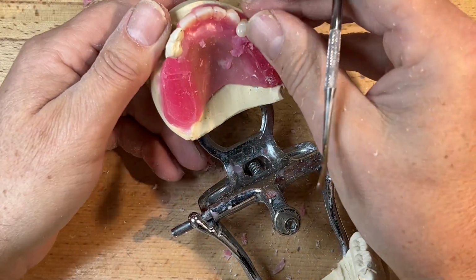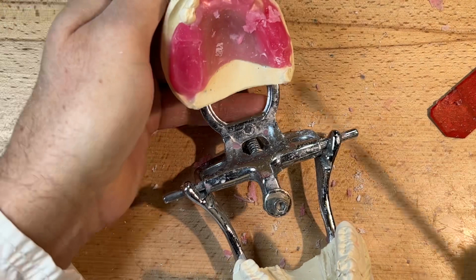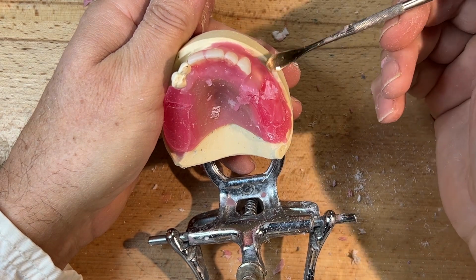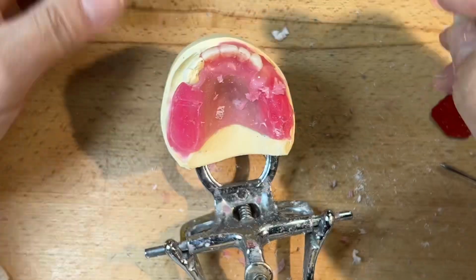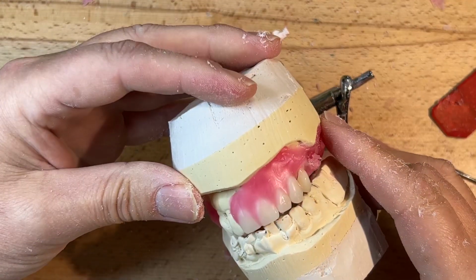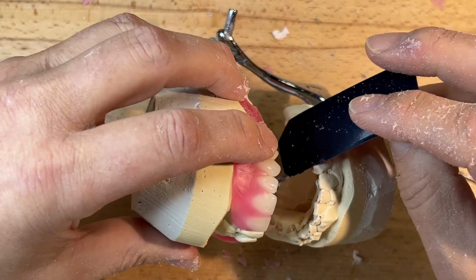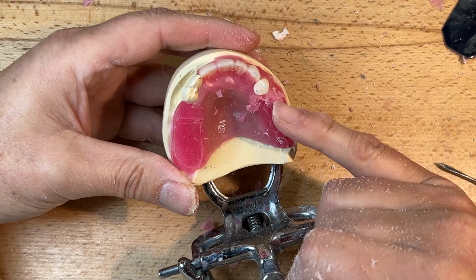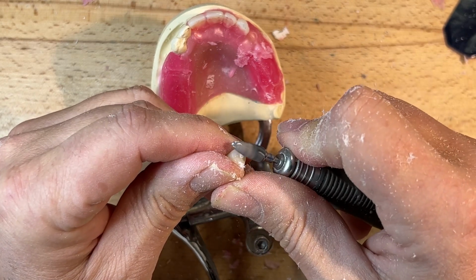Now, the anatomy of this denture tooth is contrived. I'm going to customize it to maximize interocclusal contact in centric relation in this vertical position. I'm going to leave it slightly high, just slightly high. And then I'm going to use a little bit of light pressure articulating paper without closing. You can see the contact premature on the lingual cusp, which I'm going to flatten out, and the inclined plane of the buccal cusp.